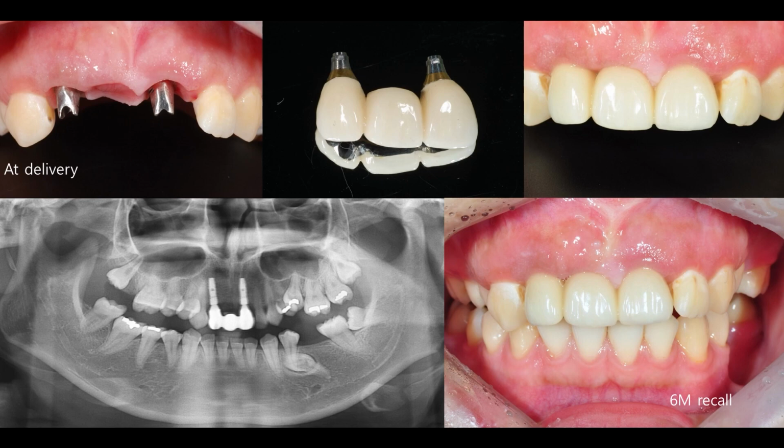Overall oral examination and examination of soft and hard tissue on the surgical site, as well as examination of the adjacent teeth and antagonist, needs to be done to come up with a big picture and then proceed with the treatment. It's very important.